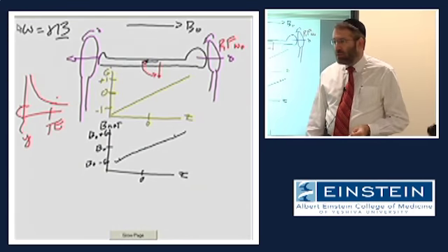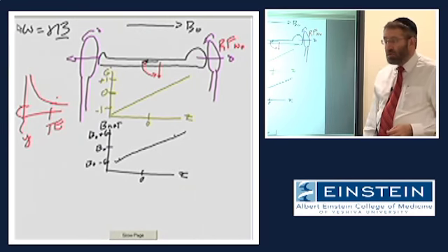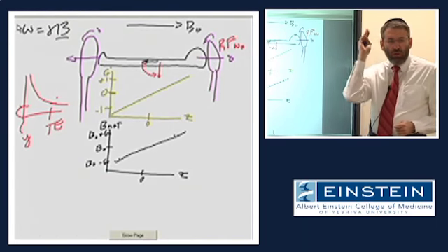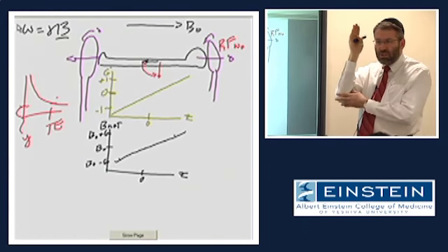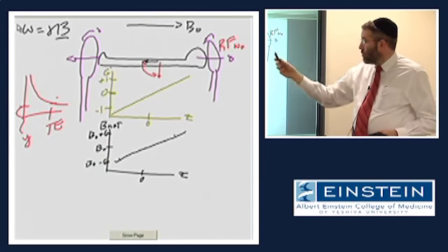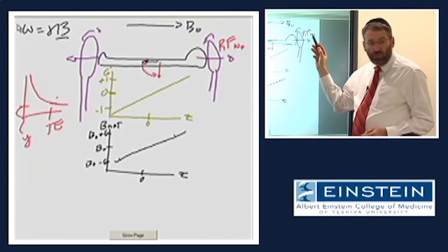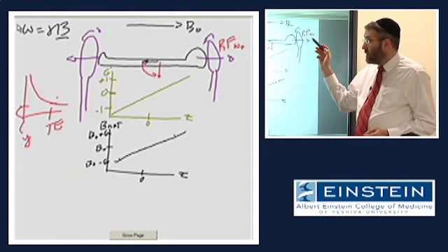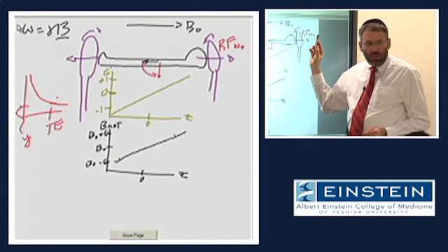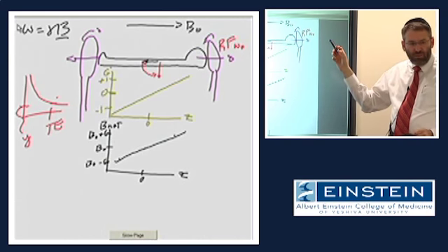Someone said tissue. Isocenter. From the isocenter. Okay? So remember, to generate the signal, we turn on our B1, which is a rotating magnetic field, right? It rotates around perpendicular to the bore of the scanner at the Larmor frequency. As a result, it efficiently transfers energy onto spins that are precessing at that Larmor frequency.